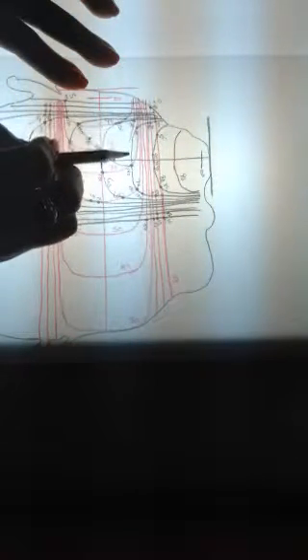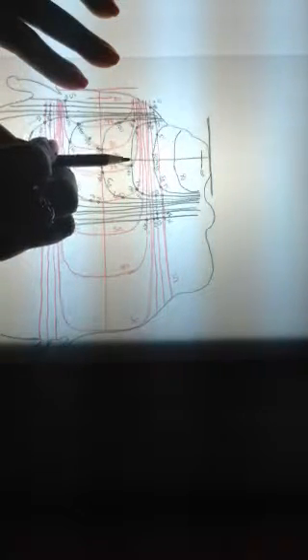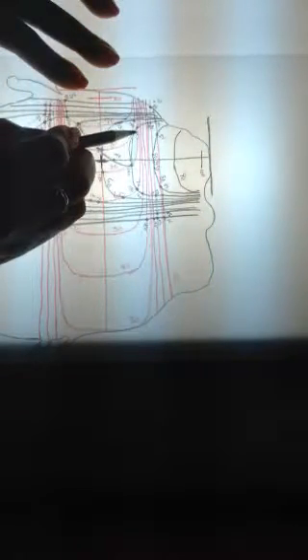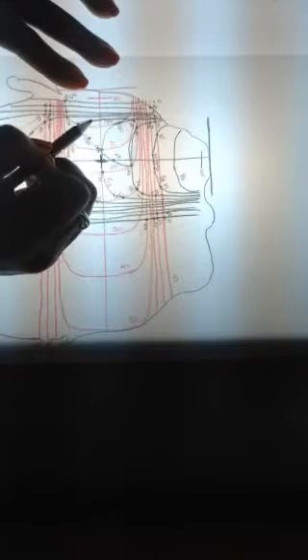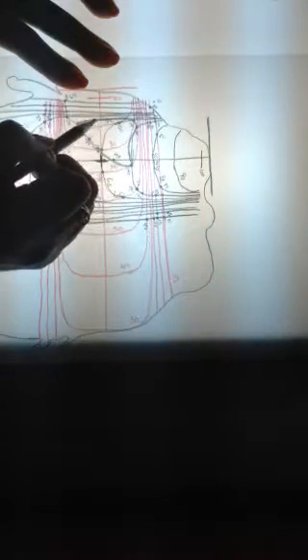More than likely not. It would have to be 70 something and 60 something. So those other 140s are probably along here somewhere. So this probably connects this way. And we do the same with this side. So right now, preliminarily, the 140% isodose line probably goes this way.